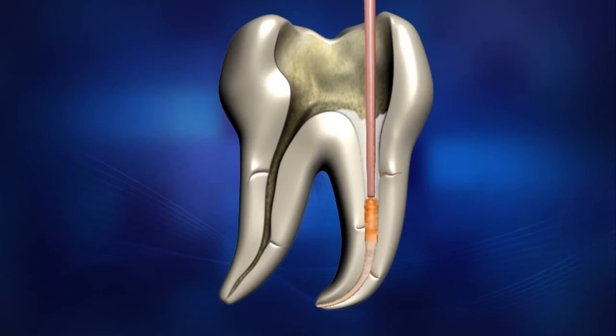Do not attempt to backfill the entire canal in one shot. After the extruded material fills the backfill space, the back pressure of the extruded Gutta-Percha will move the tip back out of the canal. Slowly withdraw the gun tip from the canal — take your time. After withdrawing Diagon's tip, use the hand plugger to pack the filled Gutta-Percha material. Repeat the backfilling process using Diagon's heated tip to make contact with the upper part of the previously extruded Gutta-Percha obturator.